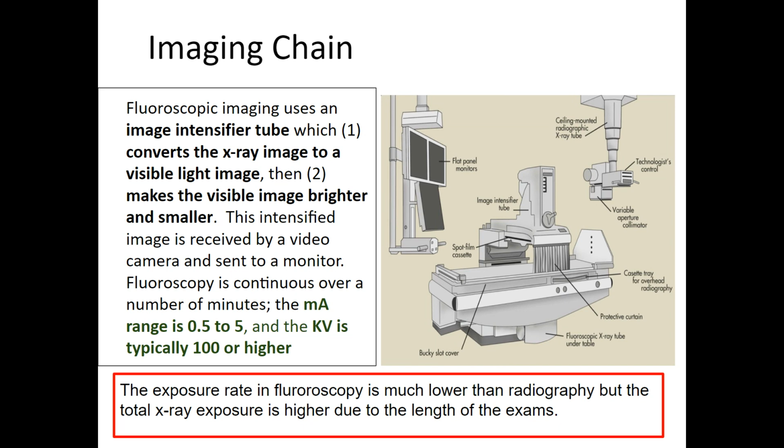Right? And in the OR, sometimes they go crazy with this. I've hit the alarm 3 times in the OR. That's 15 minutes of fluoro during like an hour and a half procedure. I'm not saying you're holding it for 15 minutes, but as it accumulates, yes. So for conventional fluoro, we can say it's low and long. The tube current, which is what mA is, is very, very low, but the time is huge, right?